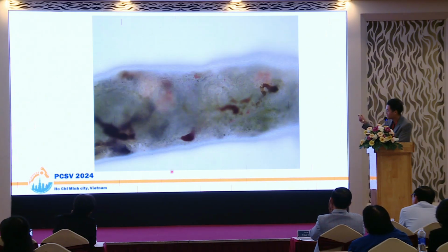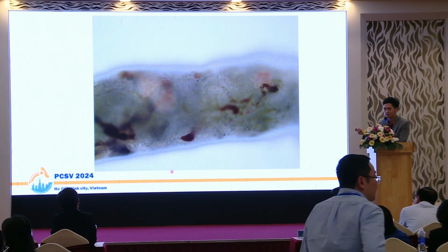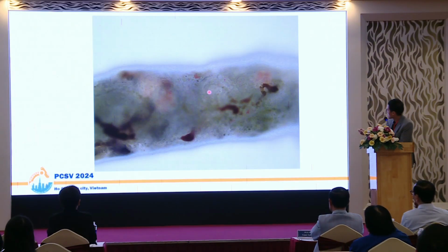When we see the biopsy sample, even with a tissue microscope or a magnifying glass, we can identify the glomeruli.